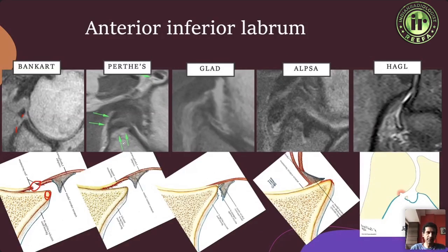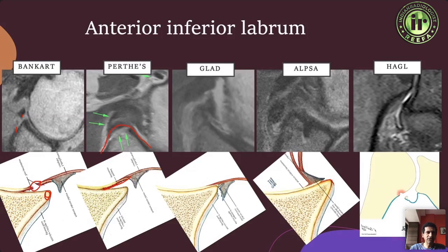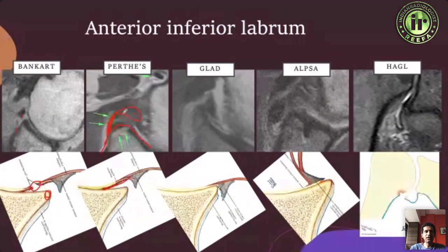The second lesion is the Perthes lesion. If you weren't quite as forceful, you get something where the periosteum strips off but doesn't actually break. You can see the anterior glenoid here, and the black structure is the labrum — this labrum coming off with the periosteum still continuous is called a Perthes lesion.